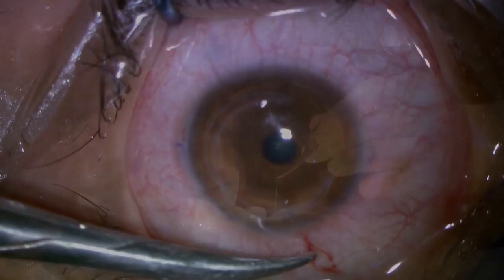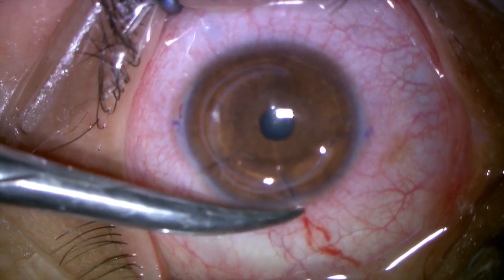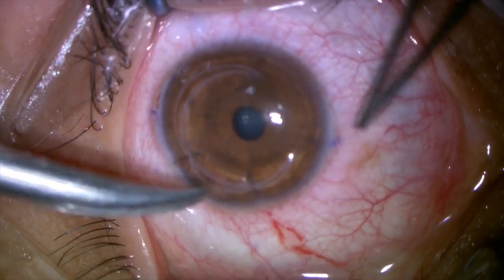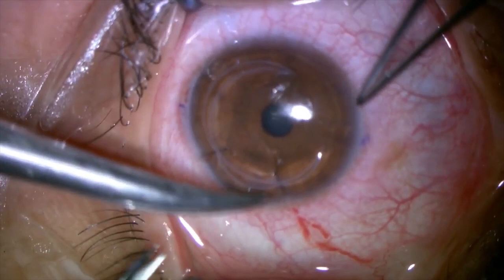So as you can see, here we've got another good apposition. It's important to block the stitch so we can have a good apposition of the edges. Here we are, we got it. Generally three passes, then two, and then one. That'll achieve, again, a good blockage of the suture. And you'll see how they basically start coming together. It is important, if you have a gap, to resuture it until you get an even surface.